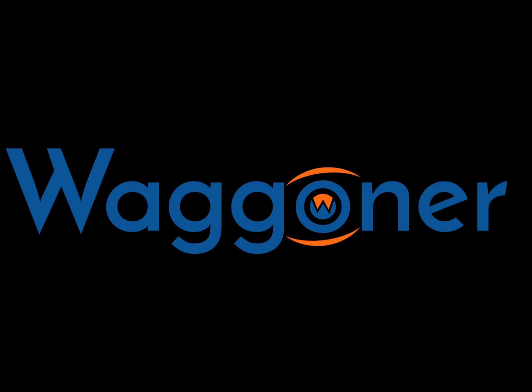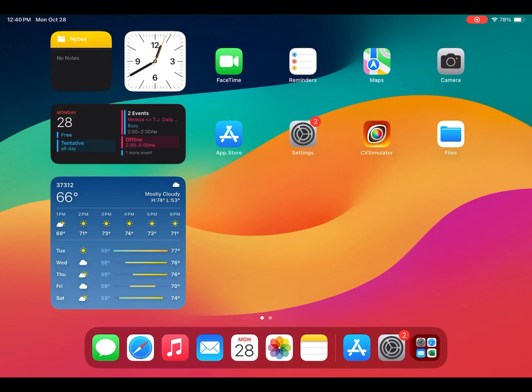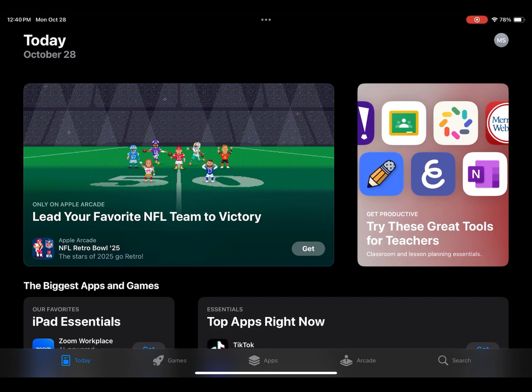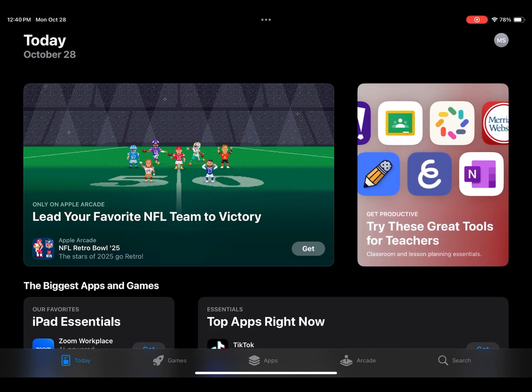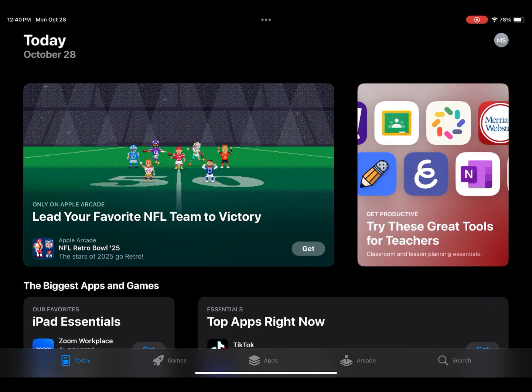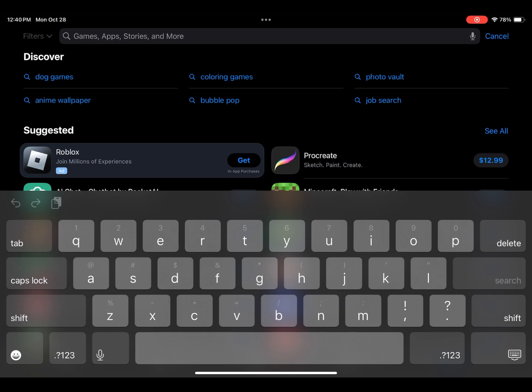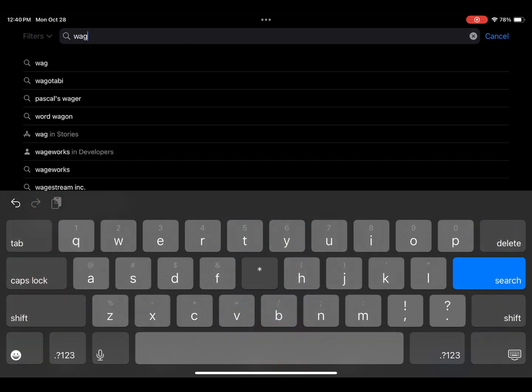Today we are going to walk through installing and activating the Wagoner ColorVision test suite, including the FAA Flight Test, on an iPad. To find the app, you will need to be on an iPad. Even though an iPhone is also an iOS device, it will not be able to find our iPad app in the store.